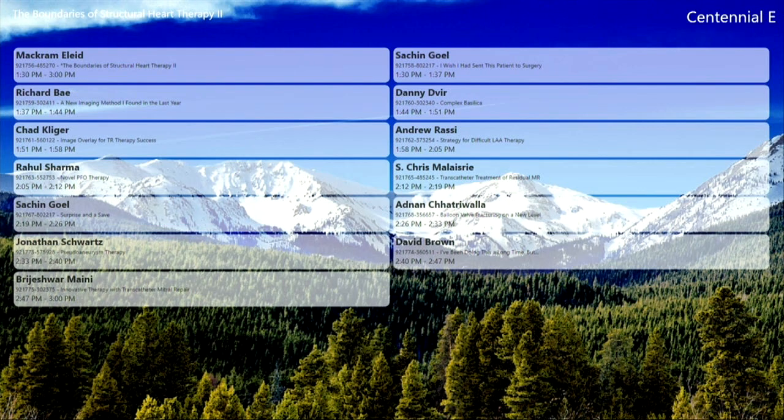Because we have seen through the core lab other sites, and the scans are just like a flip of a coin. So for us, it's not like filling the left side of the heart. You have to fill the right side. So timing is key to the acquisition for these studies. But as you can see, even in my 3D reconstruction, we've slowed down the contrast injections so that you don't get streaming of the contrast on the right side of the heart. But you do get a lot of artifact in a lot of the CT studies with streaming of contrast on the right side with the TR.